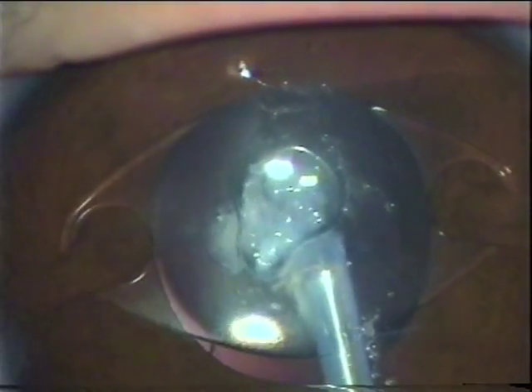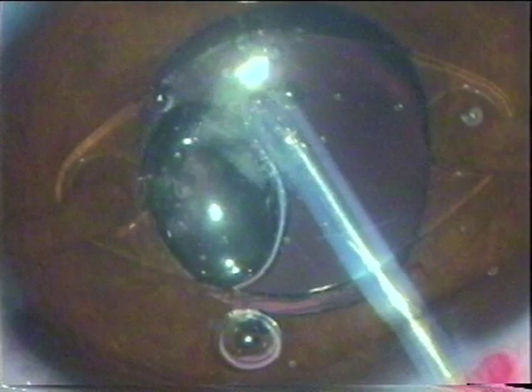The Hyaloid Artery is cut without any bleeding. That is the peculiarity of the UBA blade. Once we are sure, it is being aspirated. The nuclear area is clear.